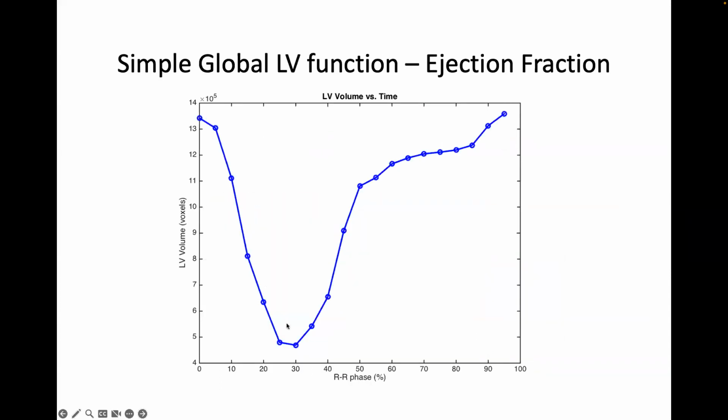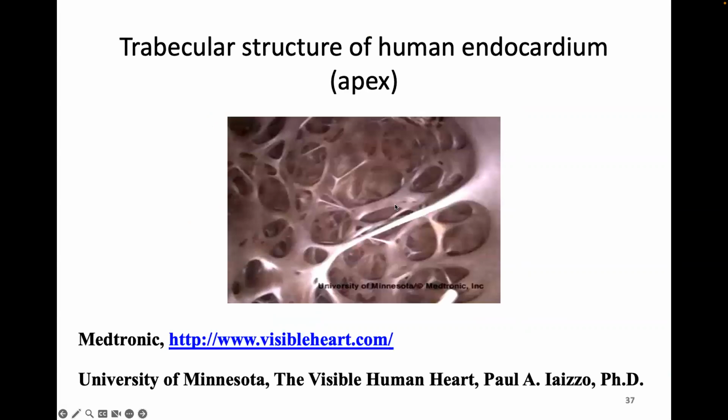Ejection fraction, you get a really good set of points for the volume of the left ventricle from CT. This is plus or minus a few percent of volume. It's reproducible. Whereas in other modalities like echo and MR, these numbers have a lot of noise on them, but in CT, it's just lock solid.